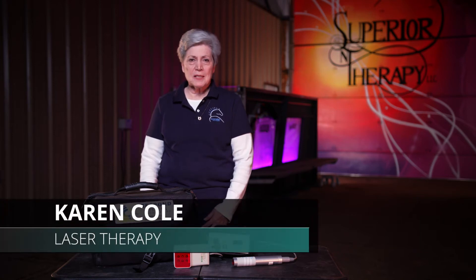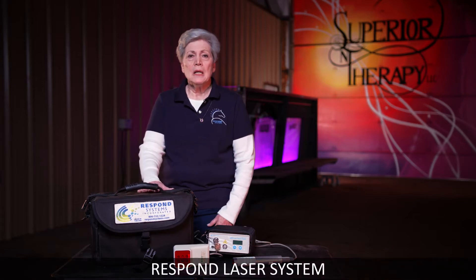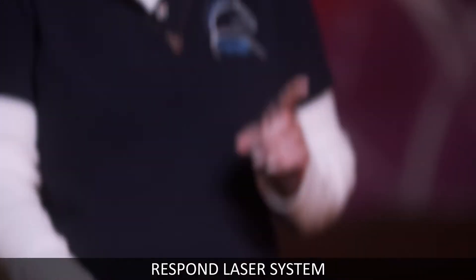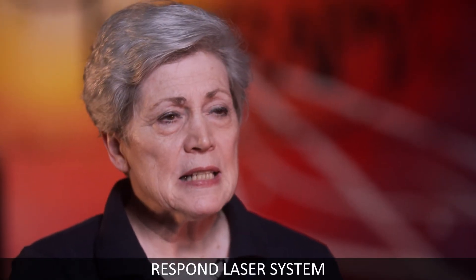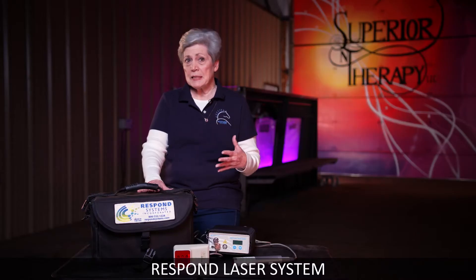Karen Cole here with Respond Systems. I'm at Superior Therapy with Summer Terry. What I want to tell you about today is the Respond Laser. There are three main things I want you to know. Number one, it is a true laser. We've done all the FDA testing, and if we've got it in print, it's correct, it's been tested.